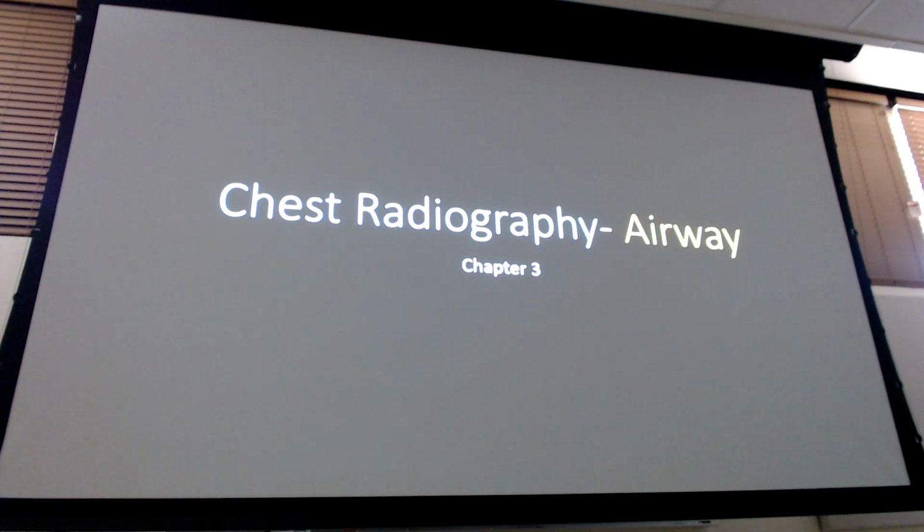When you practice this, what I would say is practice counting ribs, practice looking at stuff, use the ones I've given you, or use the annotated ones on Radiopedia. Right now as far as Radiopedia goes, and it goes to chest x-rays, just do normal chest x-ray and normal chest x-ray annotated. Please, if you get ahead, do not start looking at those disease processes yet, because it is going to spiral you down a confusing rabbit hole because we haven't broken it down yet. So don't get ahead on that yet. But practice your normals, please.